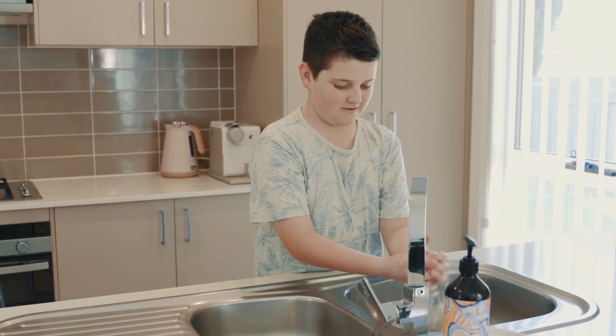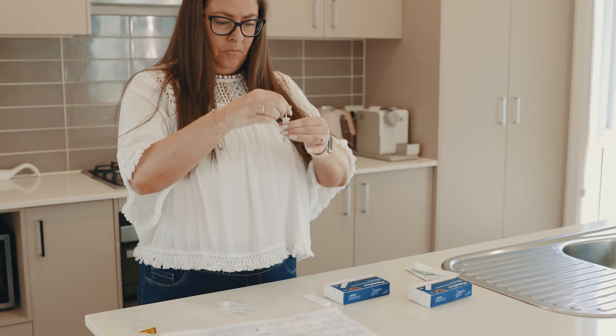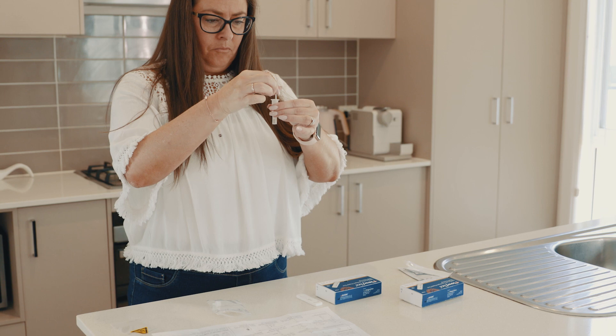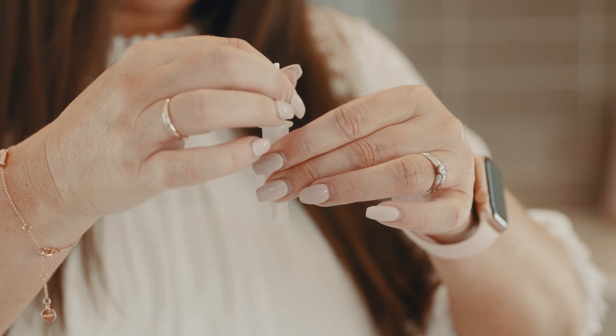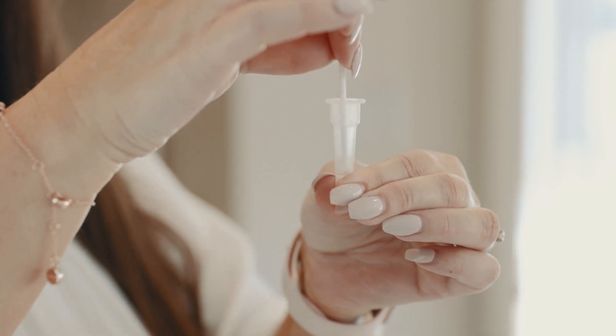Swabbing can be done on yourself or for children aged two and older. Holding the extraction tube, place the swab in the liquid and swirl for thirty seconds. Squeeze the tube, twisting the swab five times.